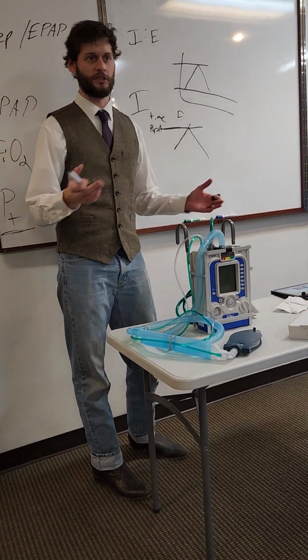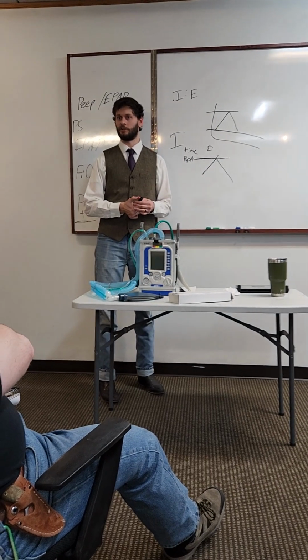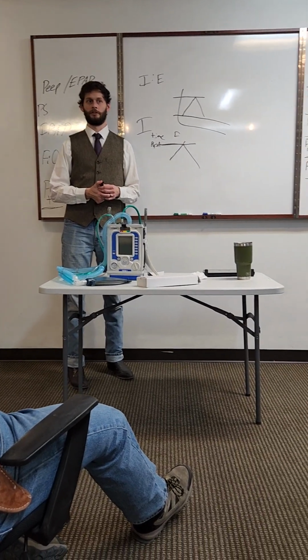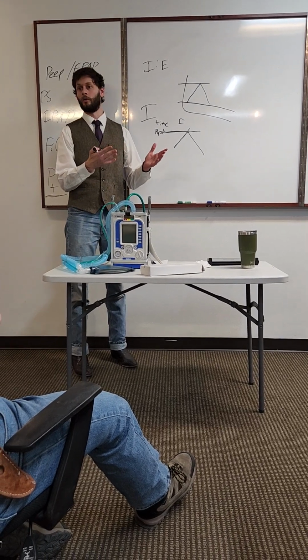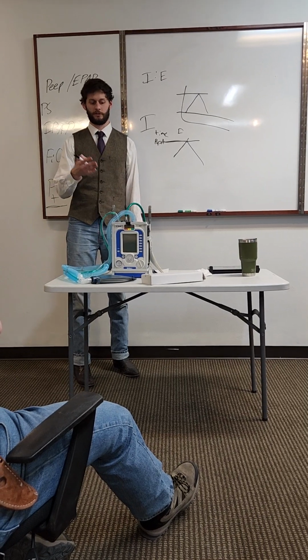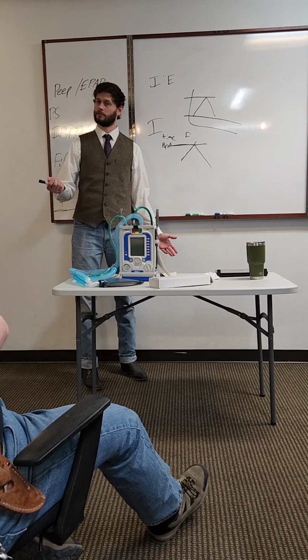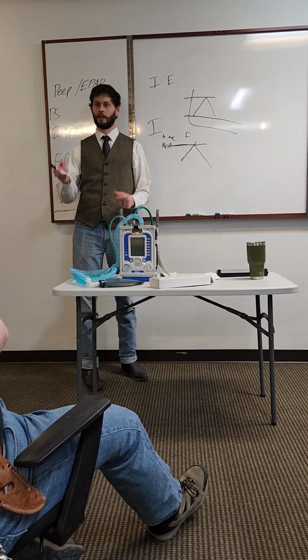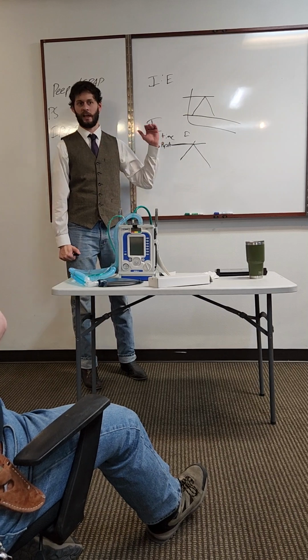So this is what we mean by the pressure regulated versus the volume regulated vent. Because with like the Newports, you have the flow. It regulates itself on the flow. So when you're in AC and V, it's giving up to a maximum flow of air, of gas. It's giving this flow. Whereas with this, it's giving up to that maximum pressure, which is good. A lot of the hospital ventilators do have that pressure cap on there, so it's not going to give anything more than the cap.